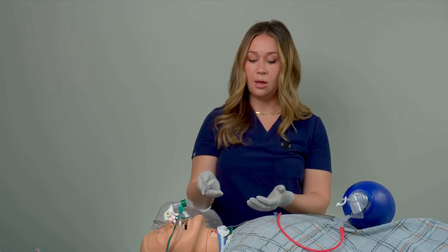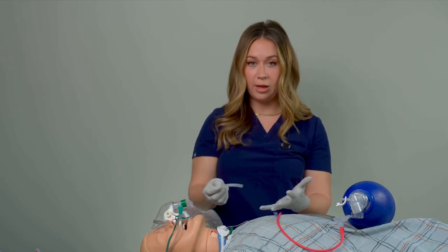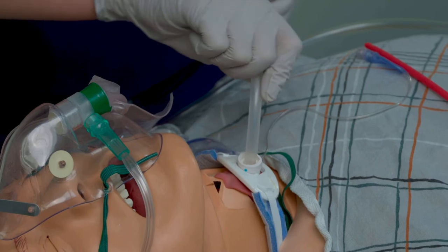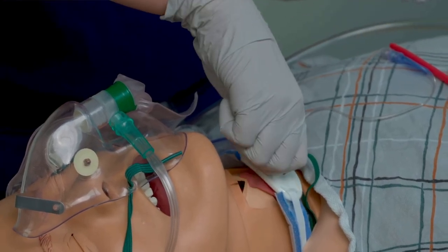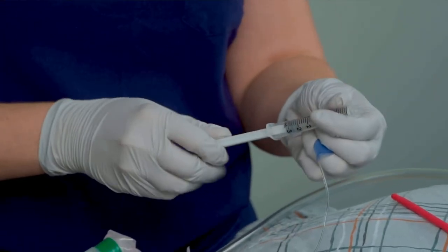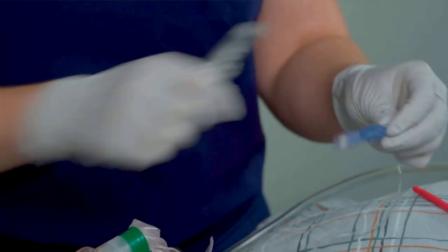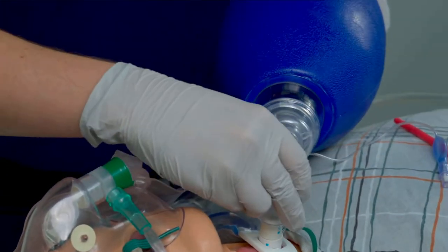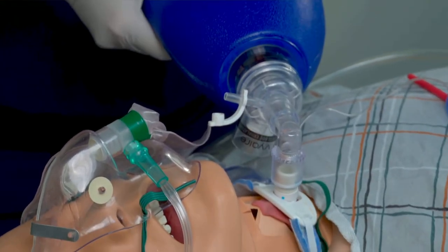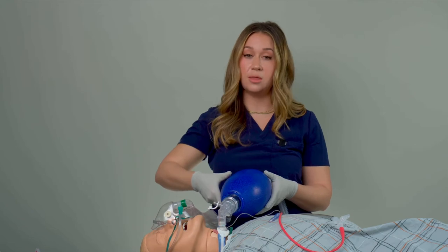An obstructed tracheostomy is not going to help you in this case. So while you're waiting for somebody to help you, you can attempt to bag the patient through the trach. To do this you want to inflate the cuff. See how the pilot balloon is inflated now — the cuff is inflated. You can note as you do this whether or not it's easy to bag them. If it's difficult, that also confirms your suspicion that the tracheostomy is obstructed. But if it's easy, then potentially you've fixed the situation and their stats will come up.